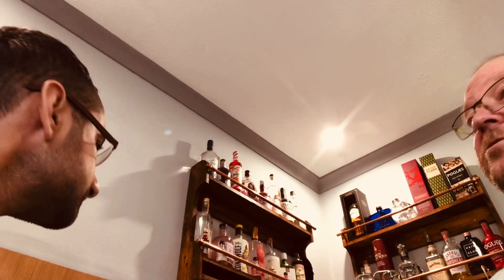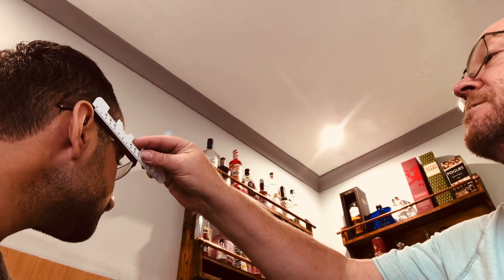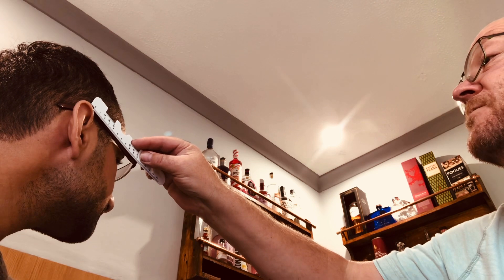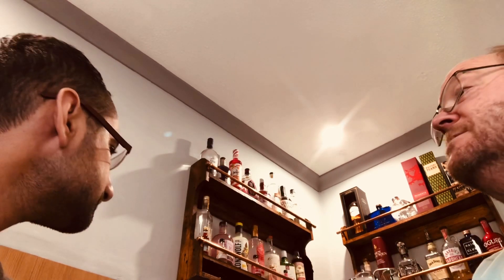Now if you turn your head the other way, I'm measuring from this side. Your ear is slightly further forward on this one — I've got that at 97 millimeters. So that is the evidence that you're not perfectly symmetrical. Very few people are symmetrical — they say the prettiest people in the world are symmetrical.